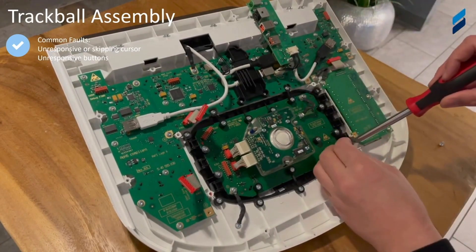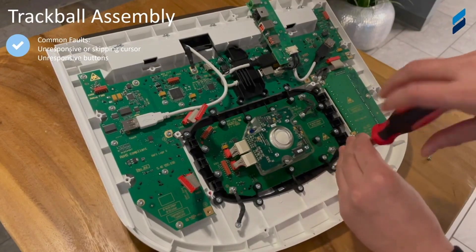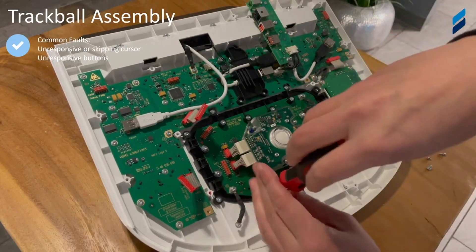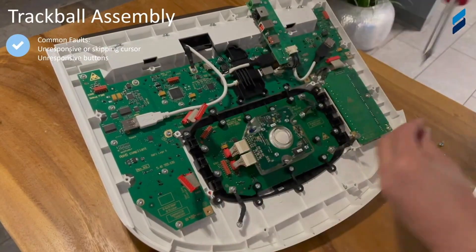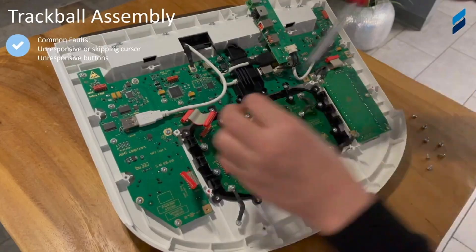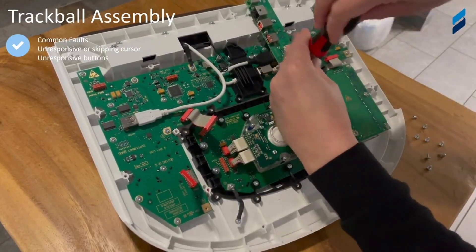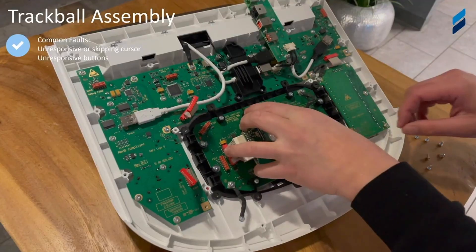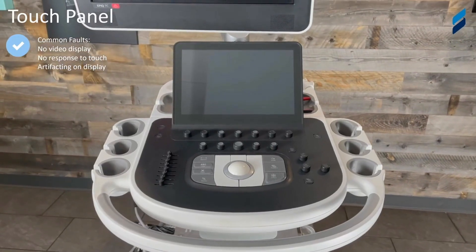You'll notice that we're actually using a manual Torx screwdriver to make sure we're being as careful as possible to not cause any damage in this area. And now the unit should just lift right off, following up the control panel.